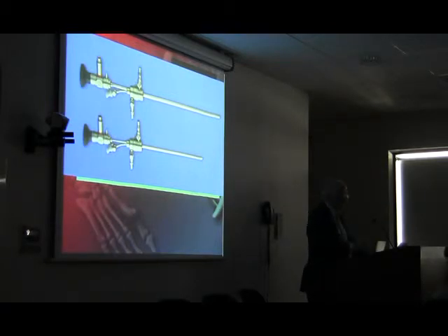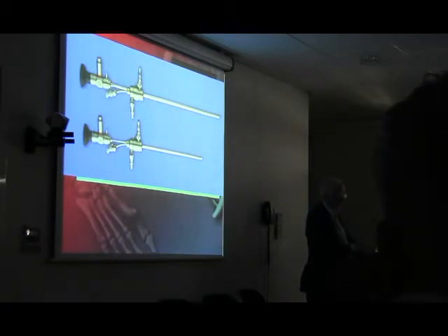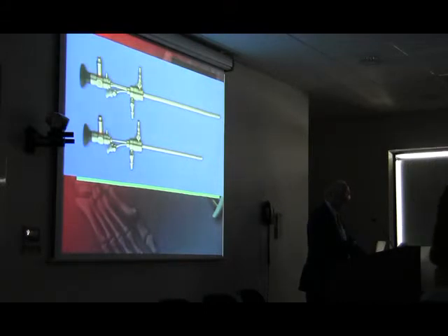So I've got about six or eight of the big ones and a couple of the small ones that I would keep in reserve if we're not able to get in with the bigger one. But this is the standard working model, this 5mm scope.